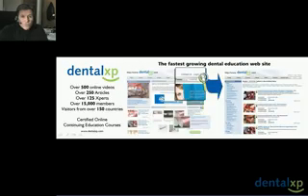One of the questions was, from Canada, what temporary restorations were used during treatment? You have a couple of options for a removable prosthesis. I like to utilize an Essex retainer from Raintree, which is now owned by Dentsply. I like to use 035 material. This is a vacuform matrix with denture teeth. And for a fixed temporary restoration, you really have an option. We use acrylic restorations as well as composite temporary restorations. It really depends on your comfort level.